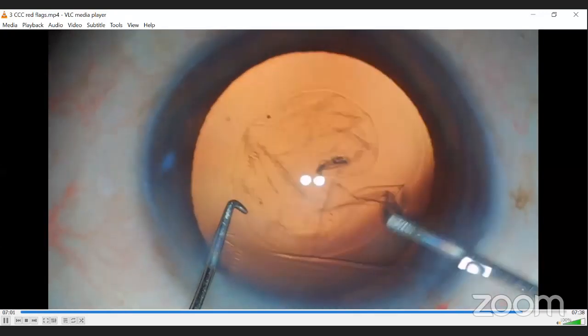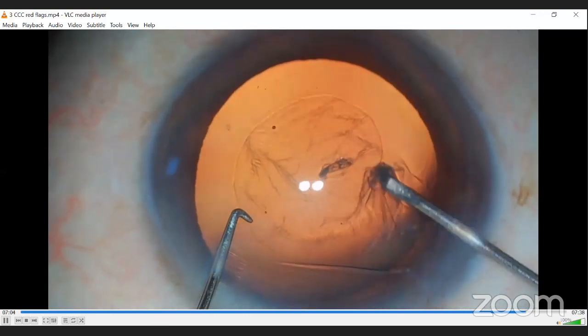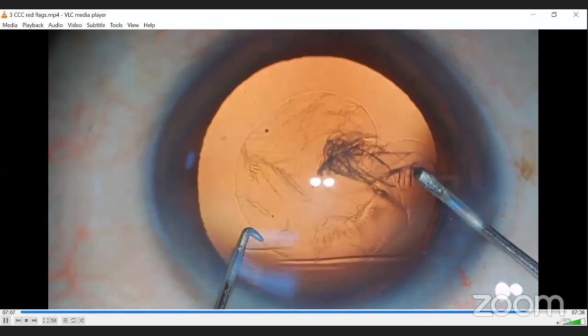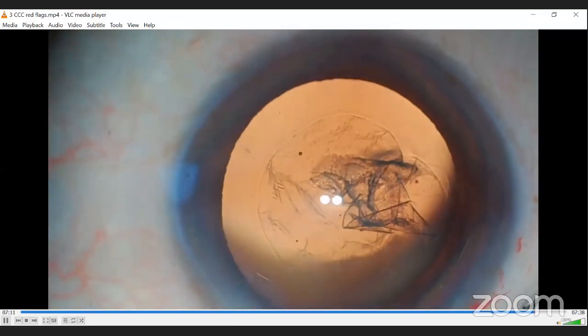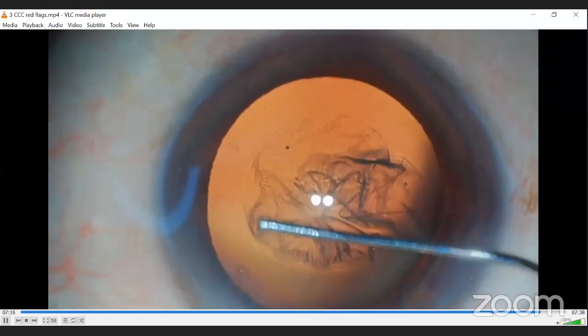Now let's look at the next case here. The surgeon is very confident. This trainee has done many cases now and is very confident with the rhexis. So he completed the rhexis. That's what he thought. And now he's going to do hydrodissection here.